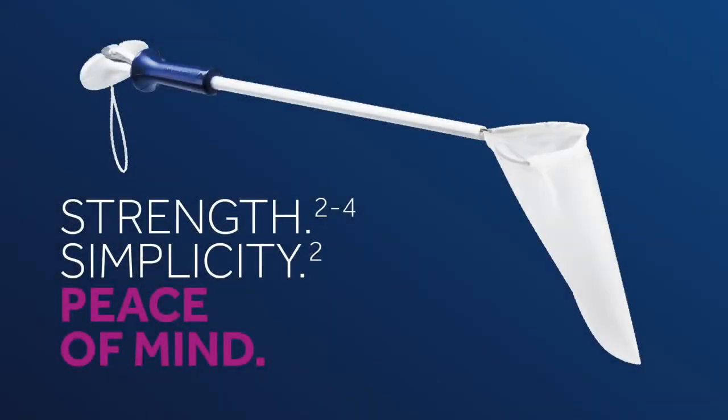That's the Reliacatch device, a strong, easy-to-use specimen retrieval bag.